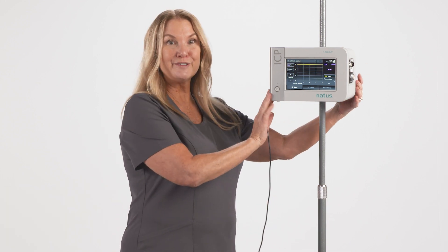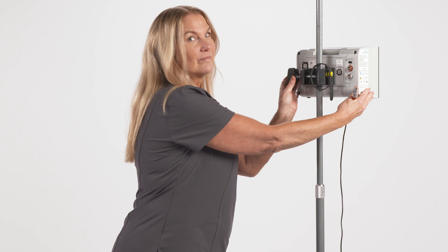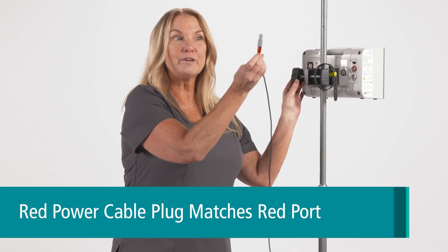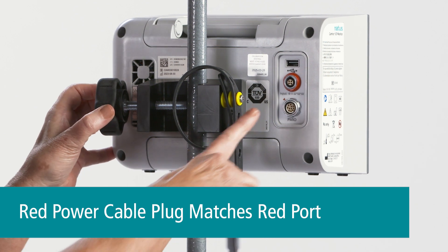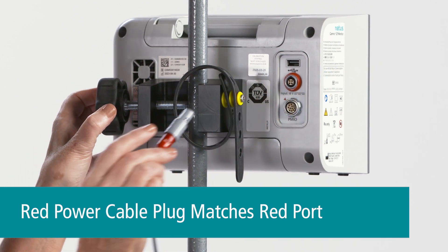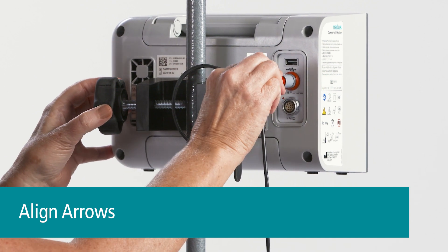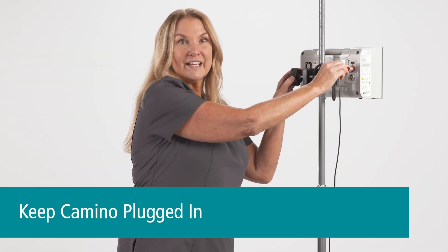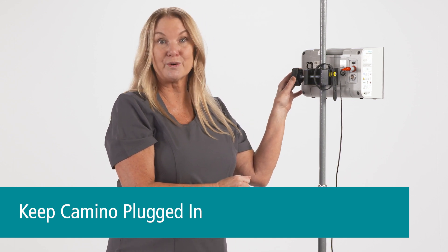I'm going to turn the Camino around so you can see the back. The power cable has a red band on it and it will plug into the red port on the back. You just align the arrows and push. It's recommended to keep the monitor always plugged in to ensure that the battery is charged for transport.